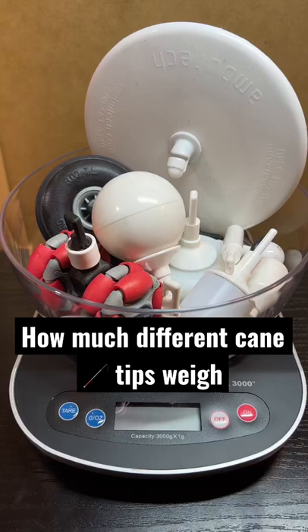Hey there, I'm a cane and mobility instructor for the Blind and Visually Impaired, and today I'm going to see how much different cane tips weigh.